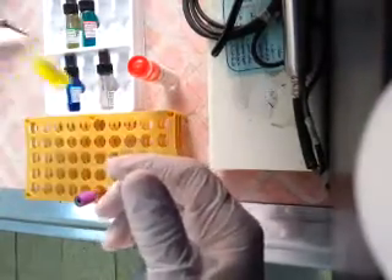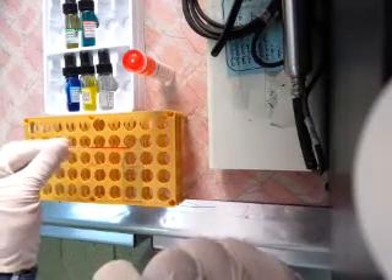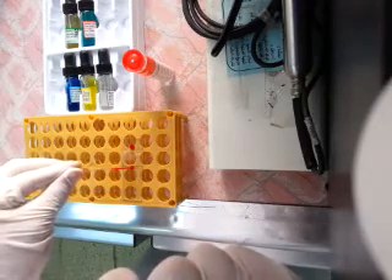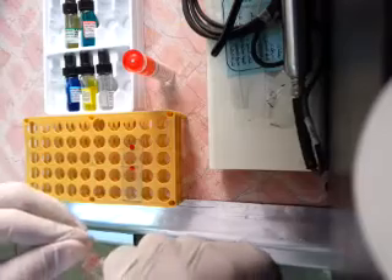We will take blood by capillary tube — three drops of blood. Put a drop of blood: three drops, one for A, one for B, and one for RH.